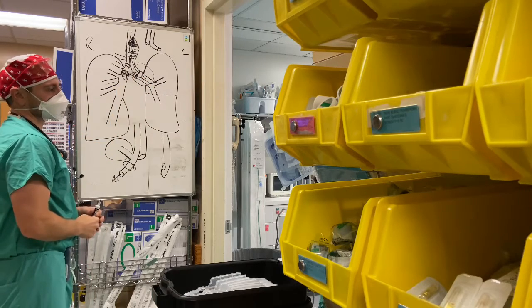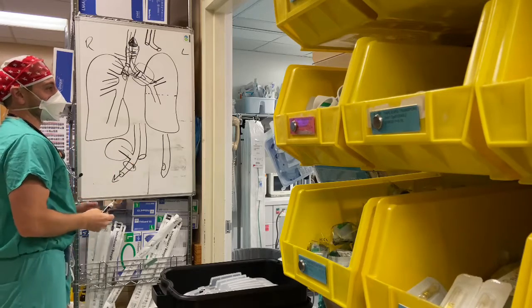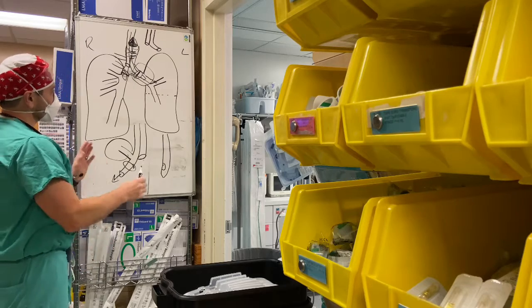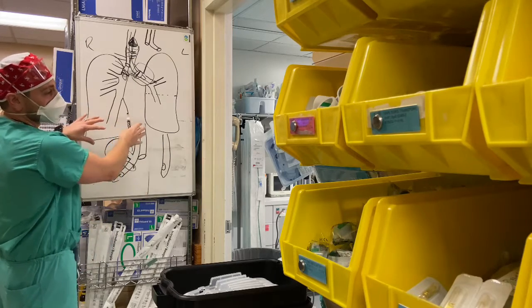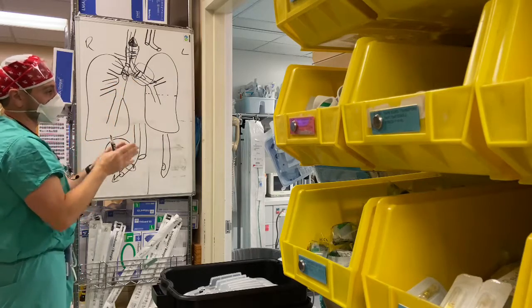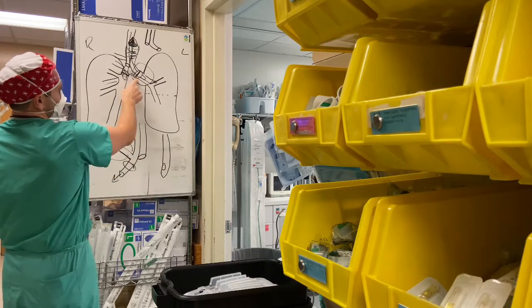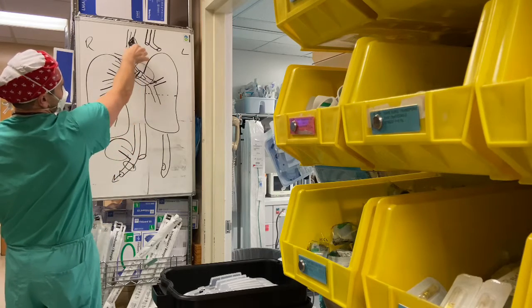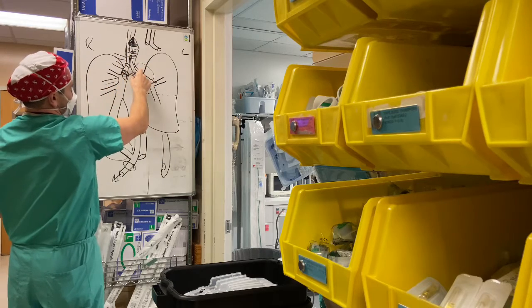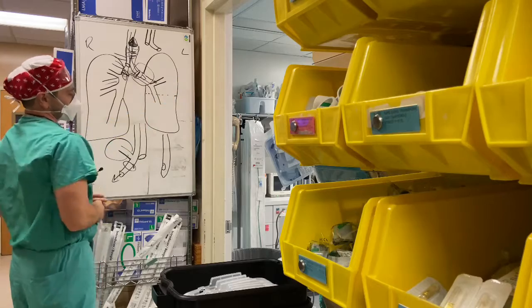Okay? There's a lot of subtlety to the airways that we're using that have specific reasons related to anatomy. So again, we would choose a double lumen tube if we had to breathe from one lung or the other, okay, and selectively do that. And the way that we isolate them is by inflating these two cuffs. This cuff allows you to blow air down into both lungs. This cuff allows you to stop breathing on that side or selectively breathe on that side.